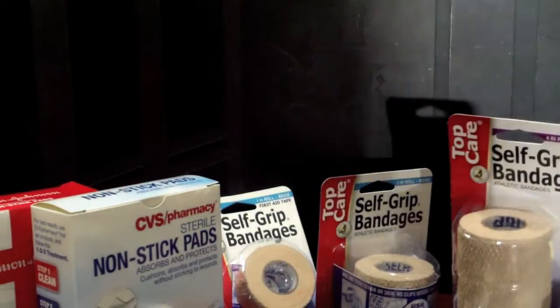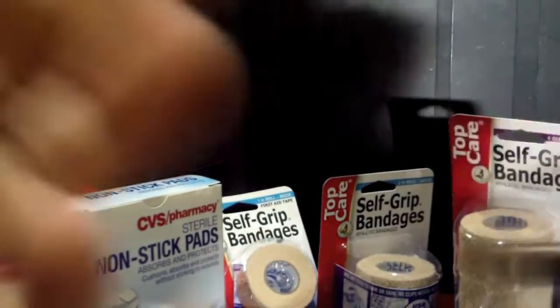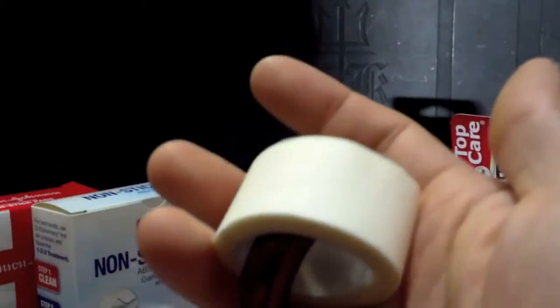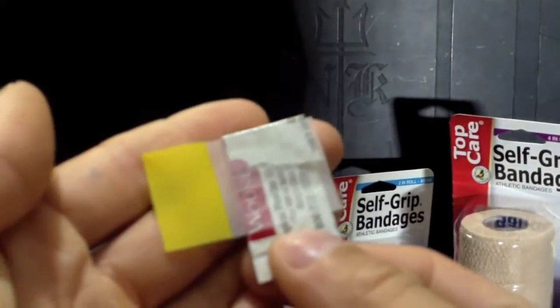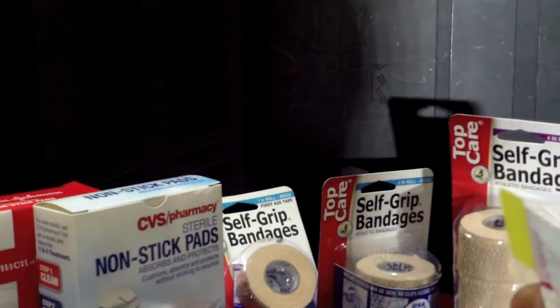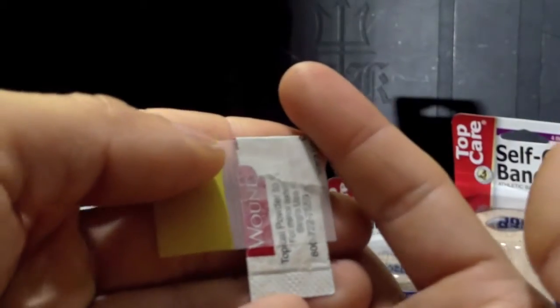I've tried cutting open the Quick Clot packet you've seen, and perhaps just using a little bit on a wound, forgoing the actual gauze, but you know, perhaps you could wrap it bare. You could take paper tape, which is a very essential part of most first aid kits, because it breathes, it won't stick very tightly to the wound, and you can tear it very easily. And I've tried that, where I ground the Quick Clot pellets into a powder. That concept then eventually became wound seal. I think that's very interesting, because these unorthodox things may seem ridiculous, but I think the medical industry sees the tactical side, the demand from consumers for something more portable, more useful, more minimalistic, and so what you get is wound seal.